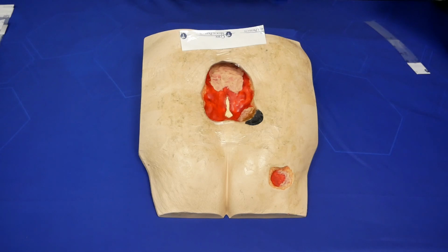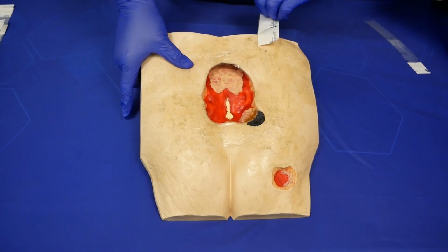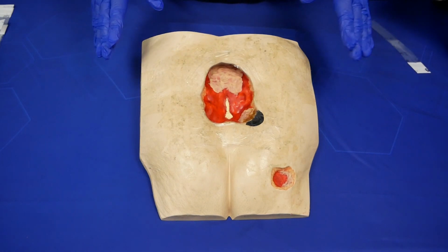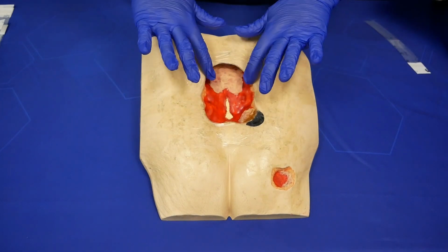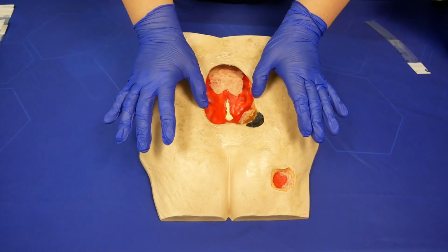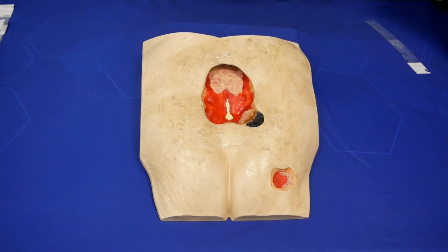The last step we do is to remove this white tab. And one last final time, I like to work the edges, that inner edge of that wound, make sure that I've got a good seal so no fluid or exudate can get underneath that drape.